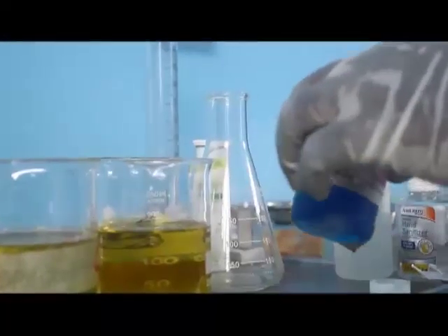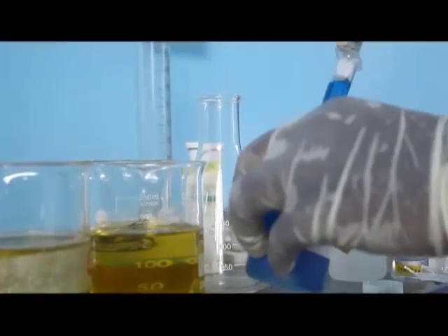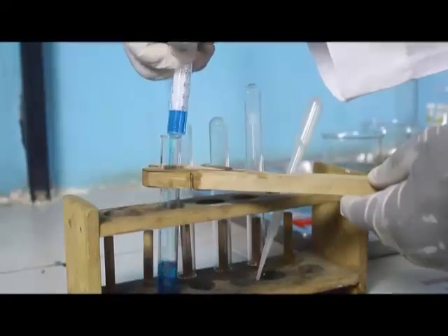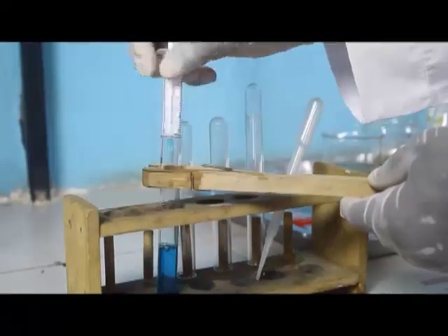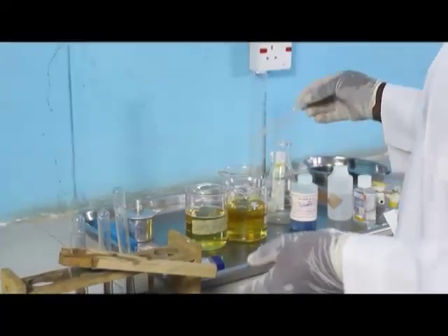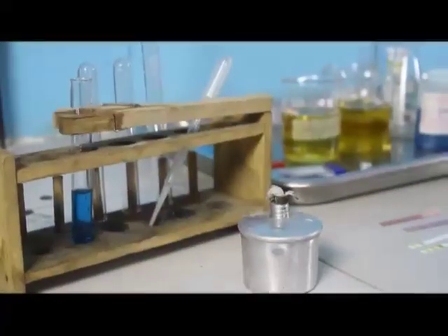Another test includes the use of Benedict's test solution. 8 drops of urine are added to 5 ml of Benedict's solution in a test tube and boiled for 2 minutes.